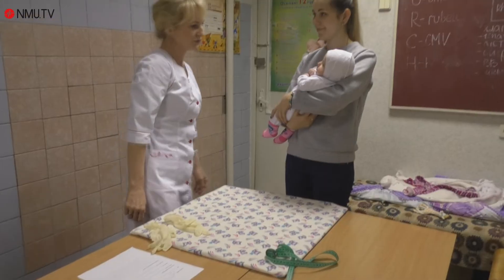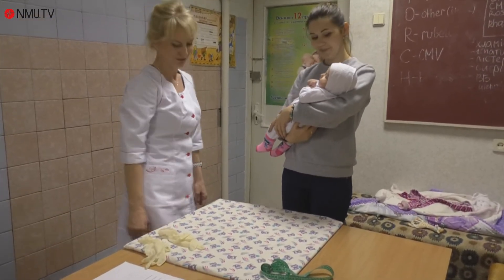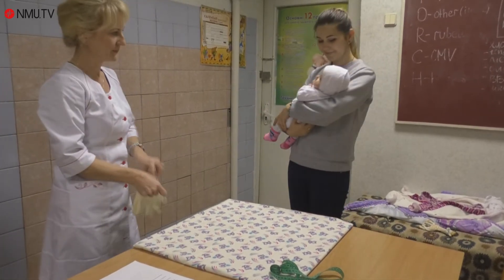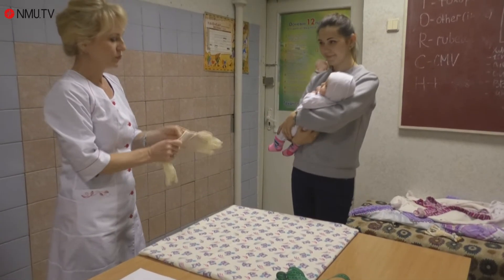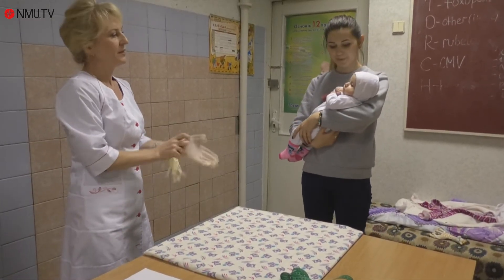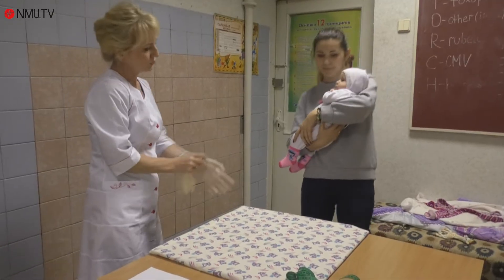I will evaluate your child's physical development. I am putting on medical gloves. First of all, we will measure the circumference of the child's head. To do this, you need to remove the cap and put the child on the changing table.